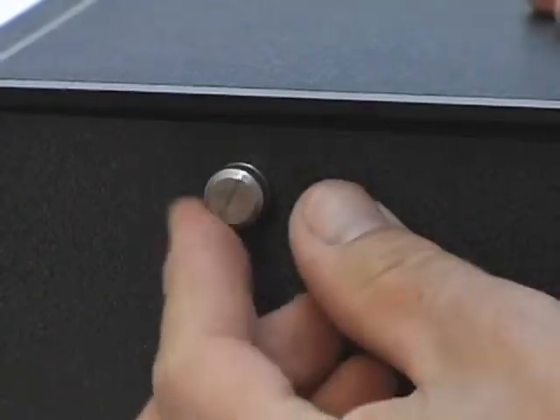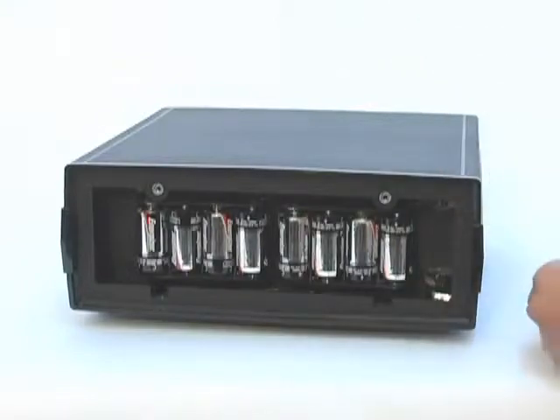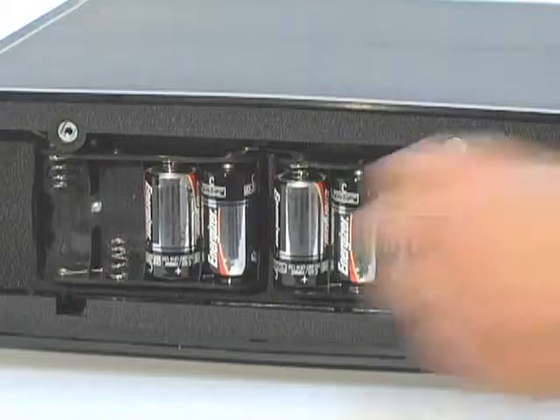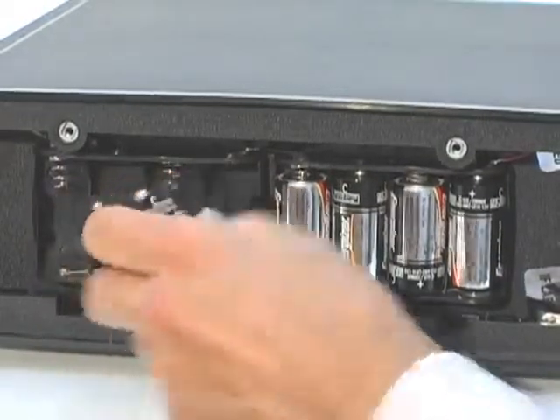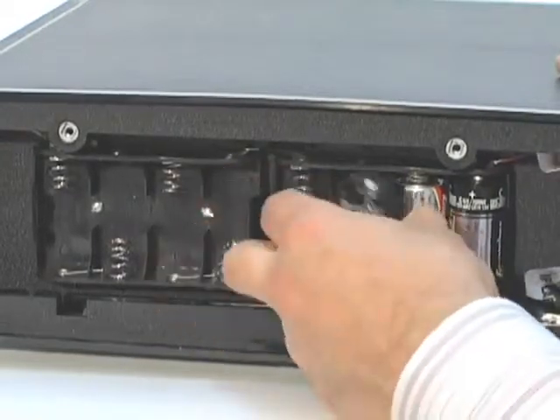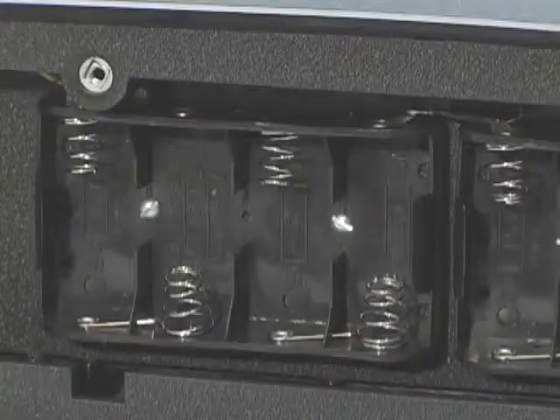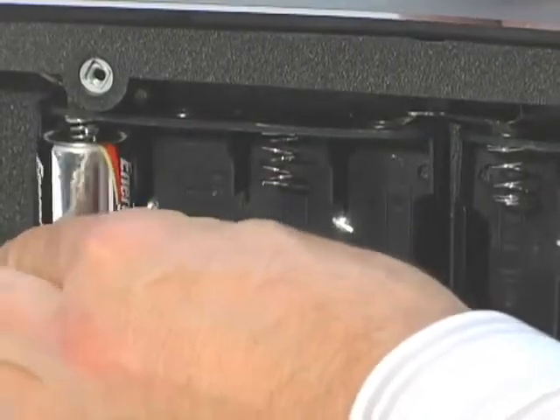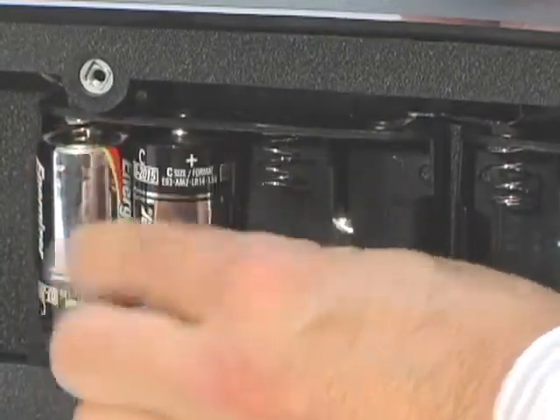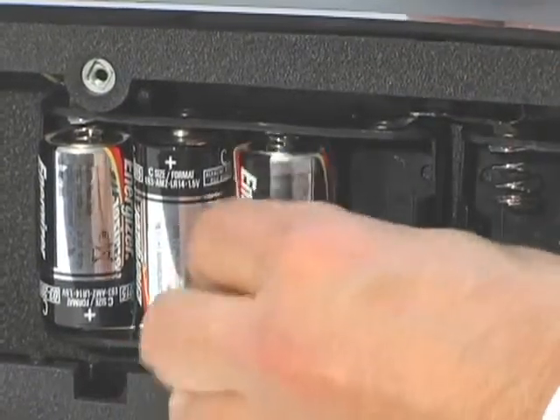Loosen the two silver knobs, then remove the battery plate by lifting up and out. The device takes 8 standard disposable C-type alkaline batteries, which typically last from 6 months to 1 year. Use extreme care while replacing the batteries. The holder is not covered by the warranty and can be easily broken. Replace the batteries in the holder as shown, with the bottom of the battery pressed against the spring. Be sure the batteries are seated correctly and spin them slightly to be sure they are making good contact.